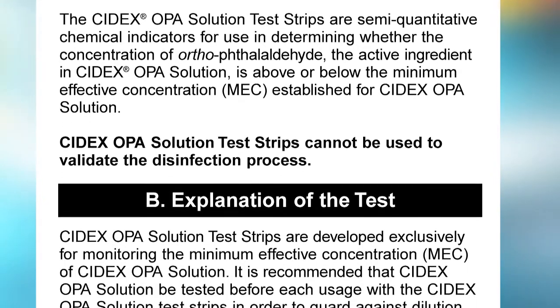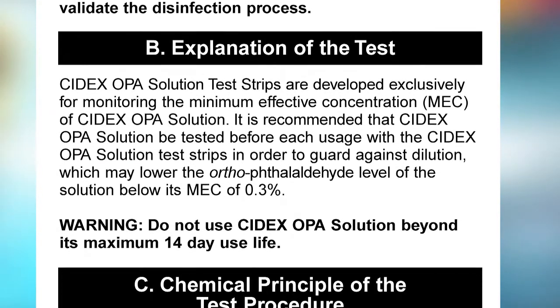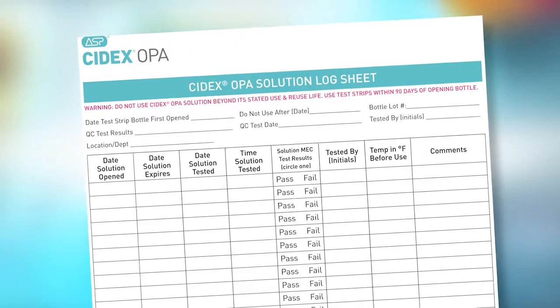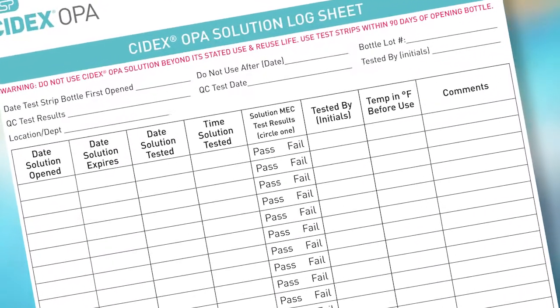Customers are also curious about how to use CIDEX OPA test strips. These are used to ensure the minimum effective concentration required for high-level disinfection, and it is recommended that you test CIDEX OPA Solution prior to each usage. To help with this process, the kit also includes a data sheet and IFU for CIDEX OPA Solution test strips, as well as a logbook to record your test results. On this sheet, you can record your quality controls, temperature reads, and test results.